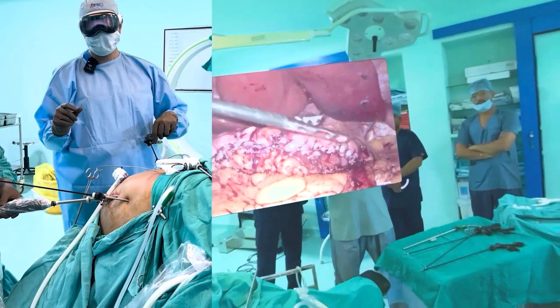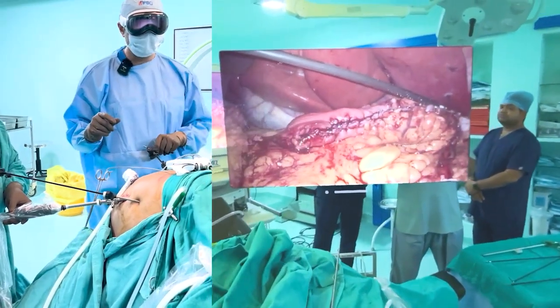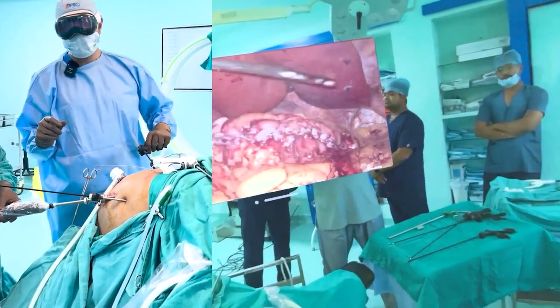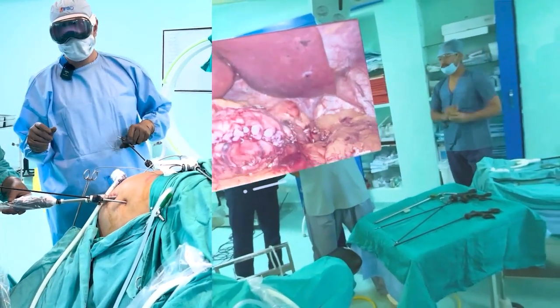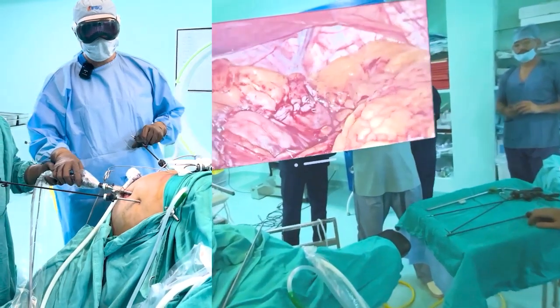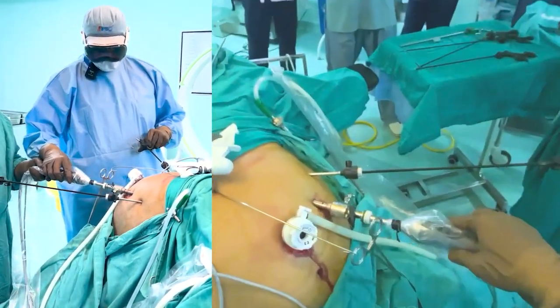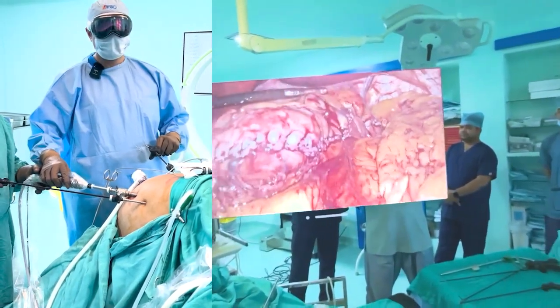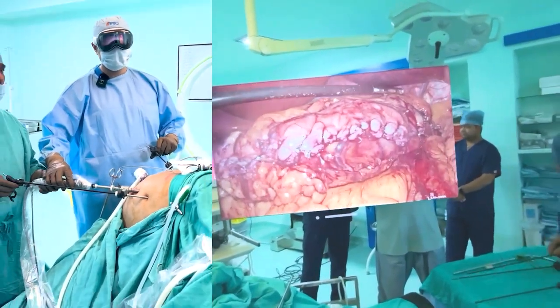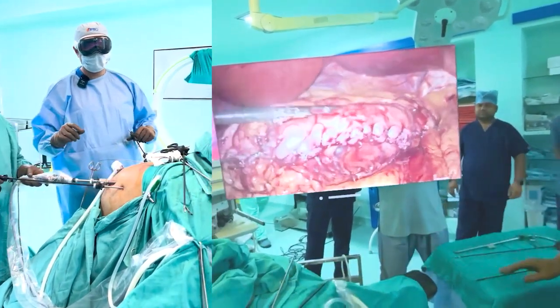The screen is very large, and during the sleeve I could even see small details that I could pick up — that's the beauty of it. At the same time, I'm very much aware of my surroundings as you can see from the external view. I can manage the camera position, take the camera in my hands, and know everything about my surroundings. That's the advantage of the Vision Pro.